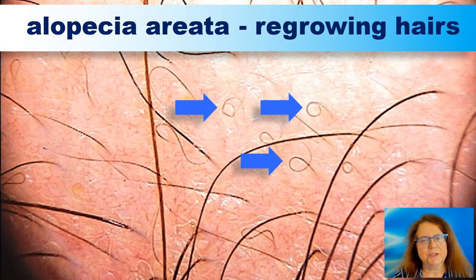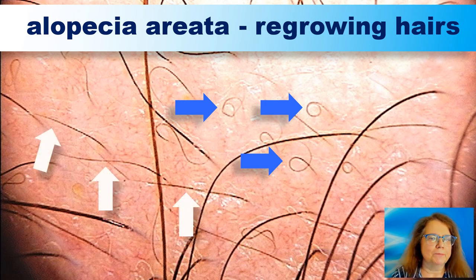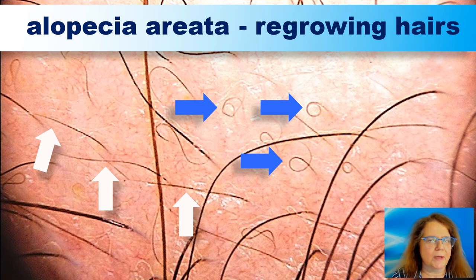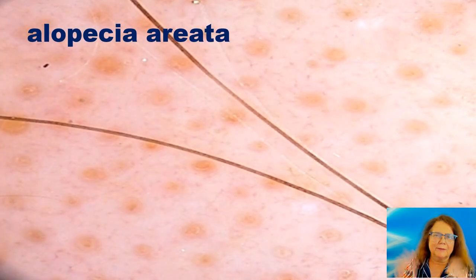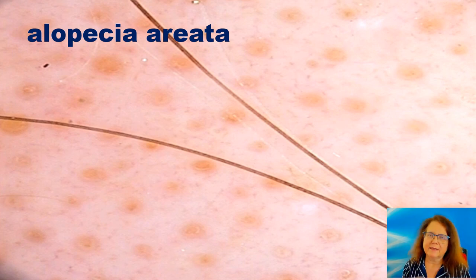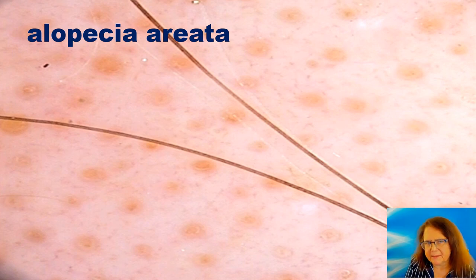This is a typical image of a patient with regrowing hairs in the course of alopecia areata. The blue arrows point to the pigtails. The yellow dots mark hair follicles which are empty in the sense that they contain no hair shaft, but they contain sebum and keratotic material which make them yellow.